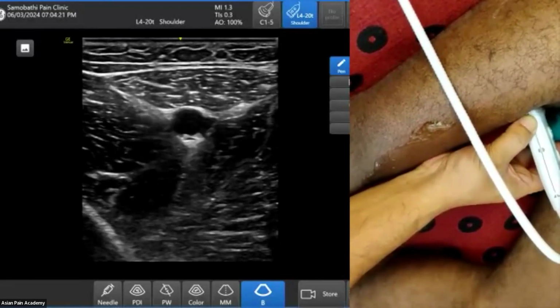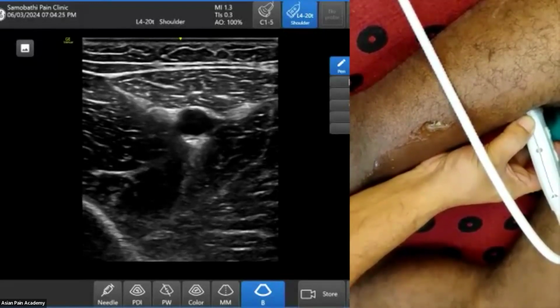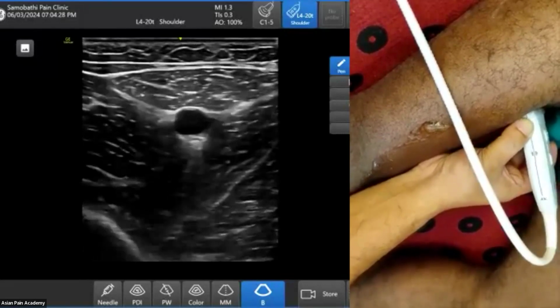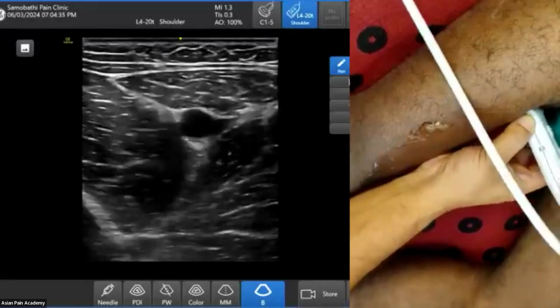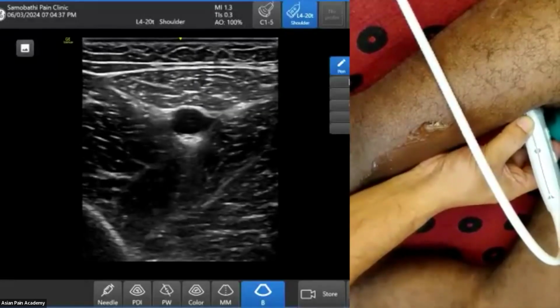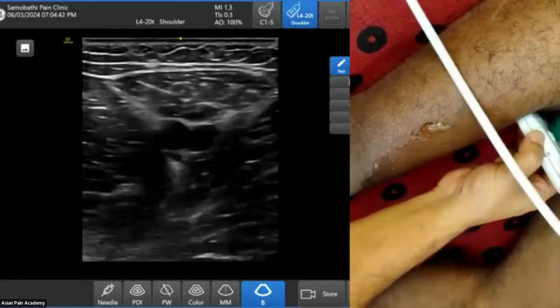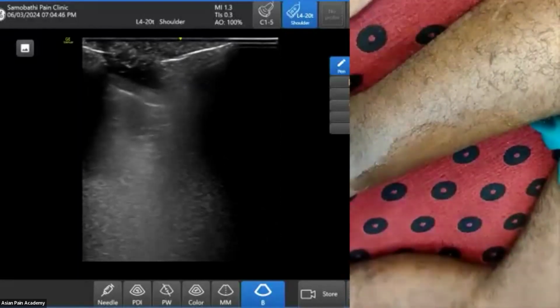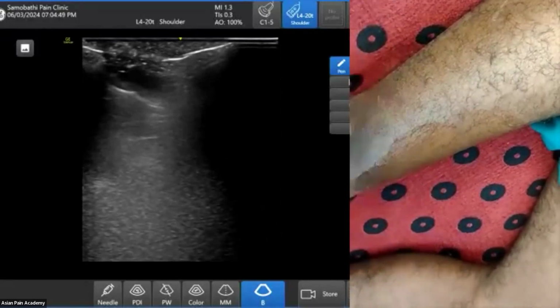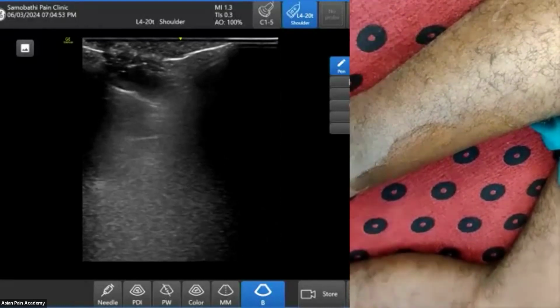This is two honeycombs now. Have you all perceived any problem? Clearly perceived or not? Yes, sir. Okay, if I move it so much so that you see the nerve honeycomb appearance, otherwise it remains. Okay, so this is one thing around the knee. Now let us see the femoral nerve, obturator nerve, and sciatic nerve from the anterior side.